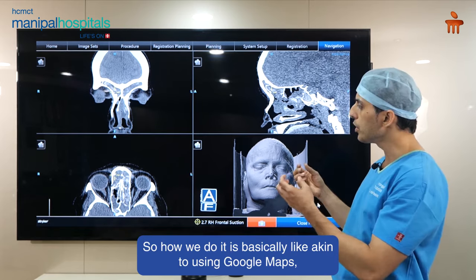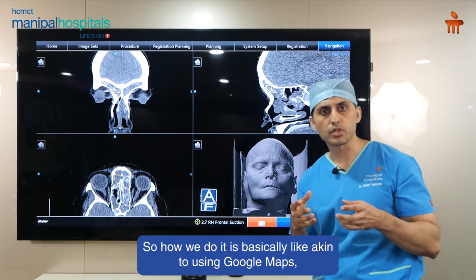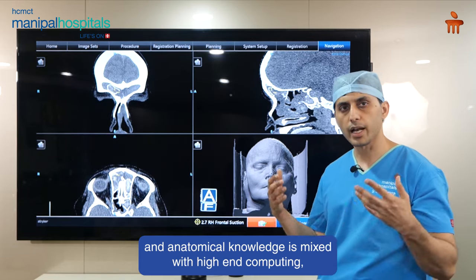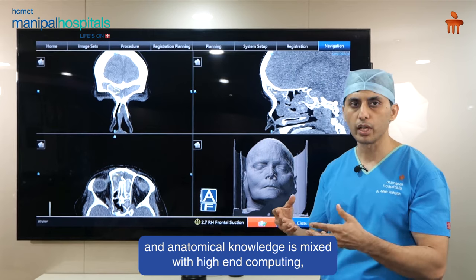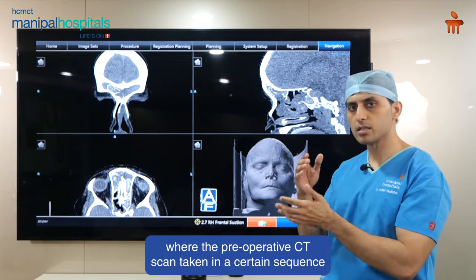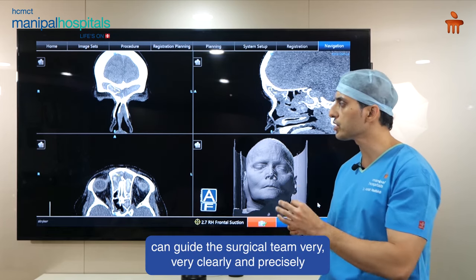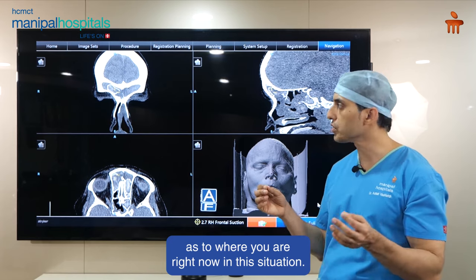How we do it is akin to using Google Maps but in a far more precise way, where surgical knowledge and anatomical knowledge are mixed with high-end computing, where the pre-operative CT scan taken in a certain sequence can guide the surgical team very clearly and precisely as to where you are right now in the situation.